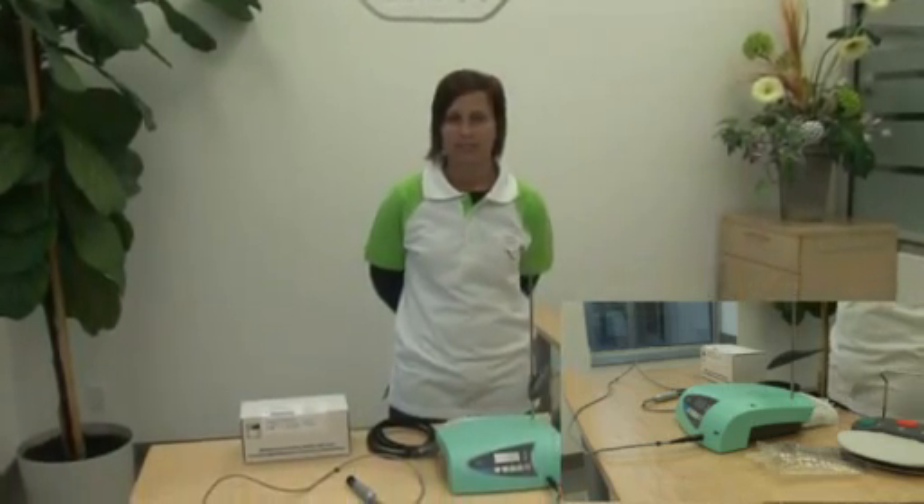Hi, this is Carly with W&H. I'm going to show you in this session how to install the W&H standard irrigation tubing set.